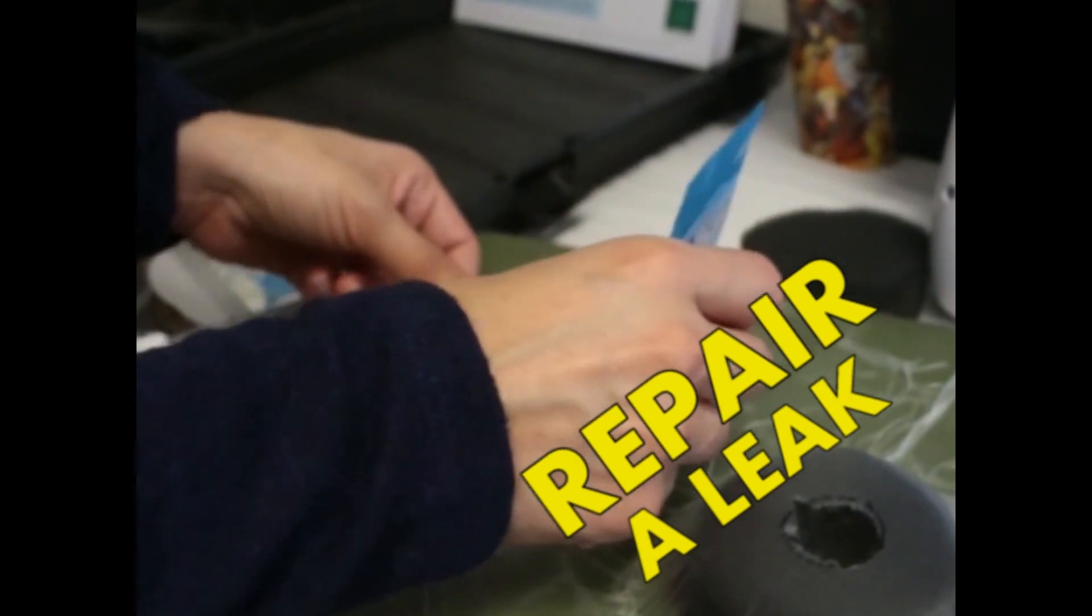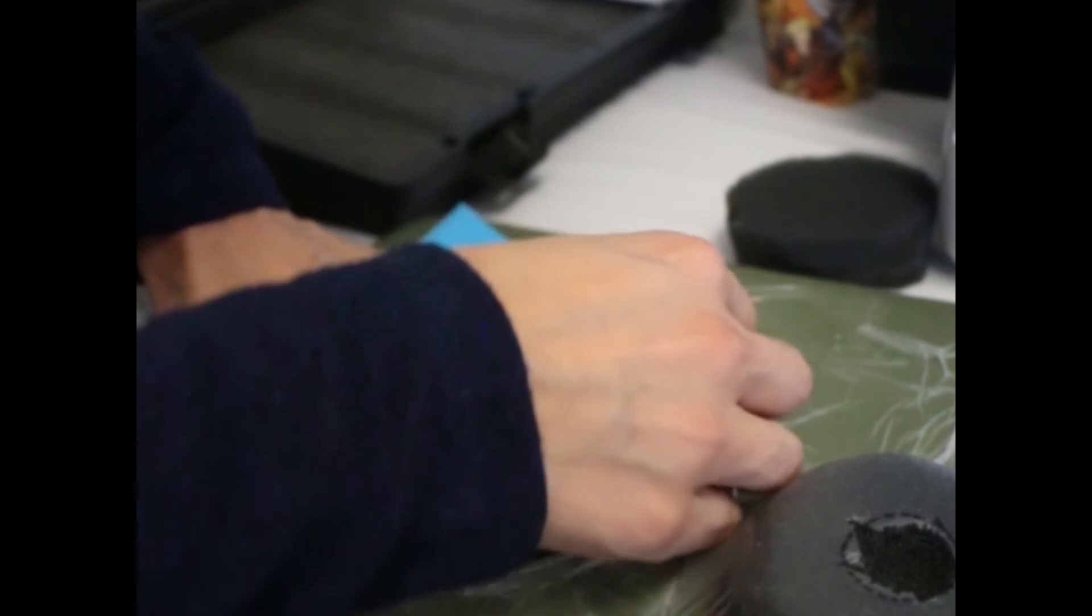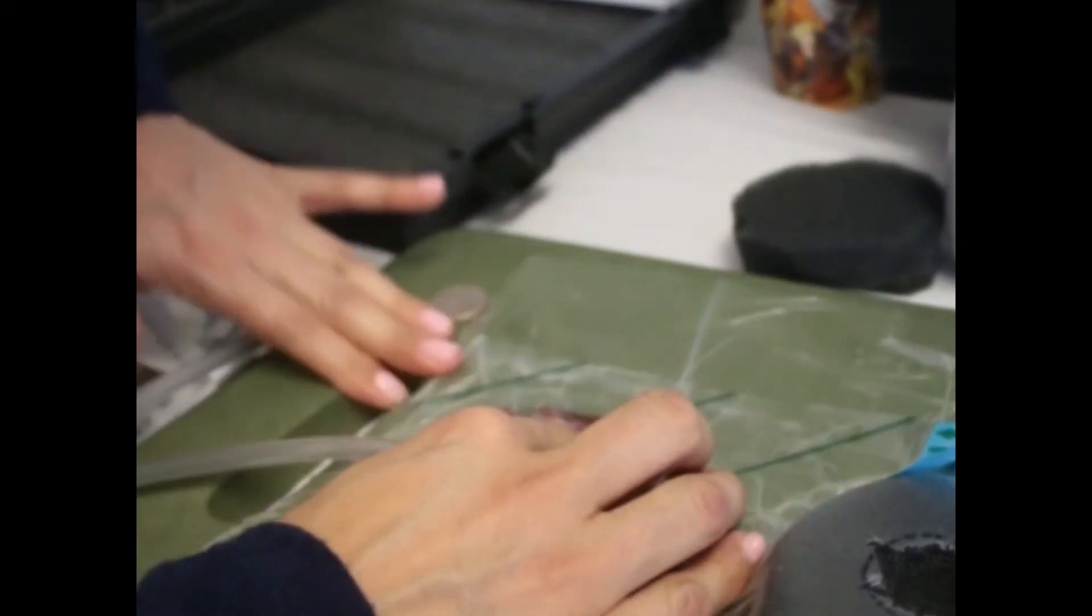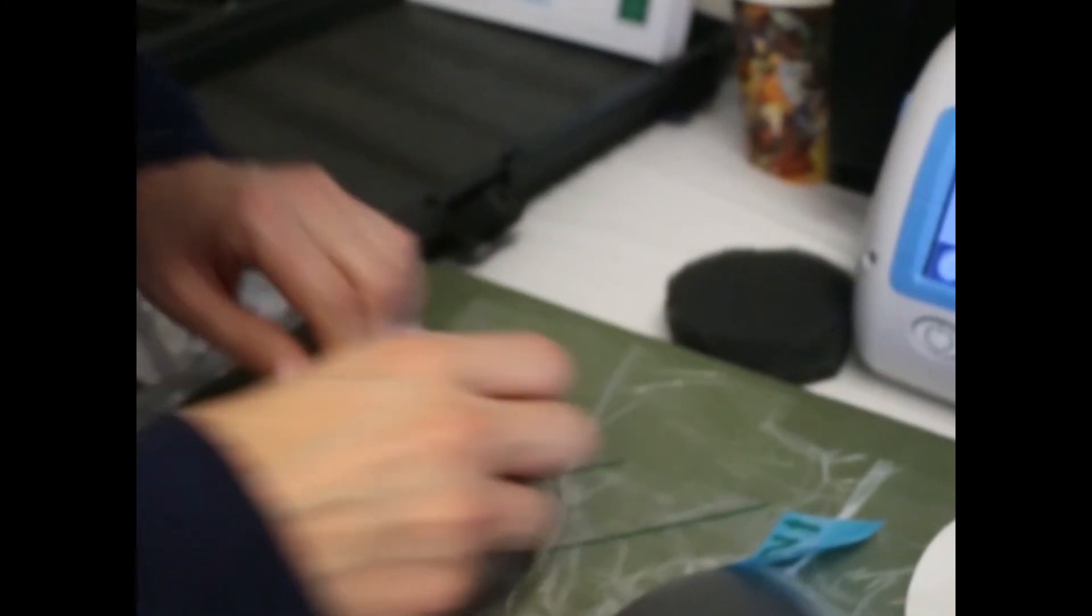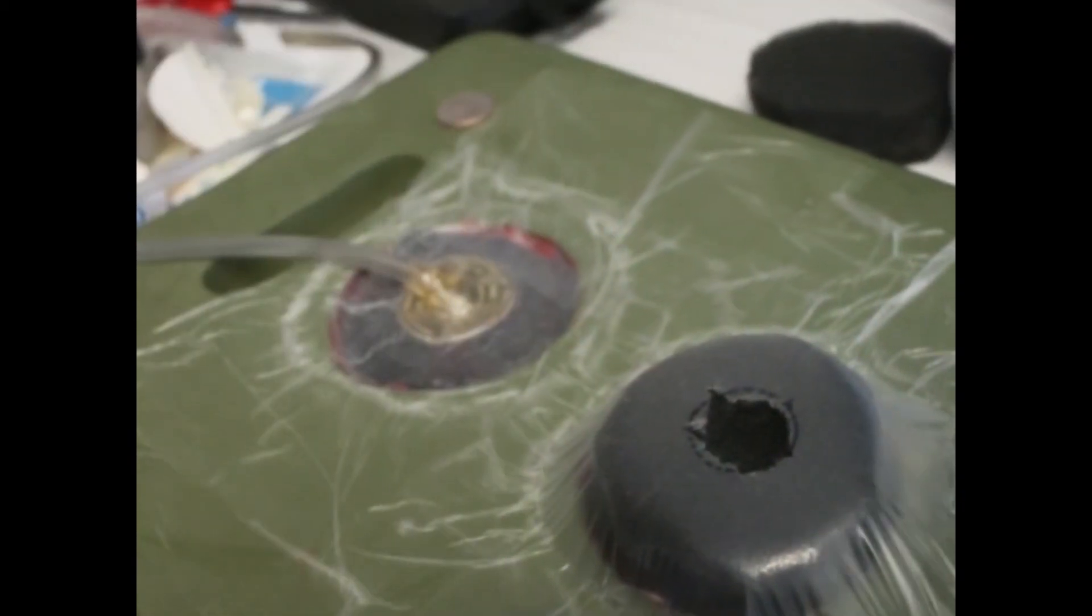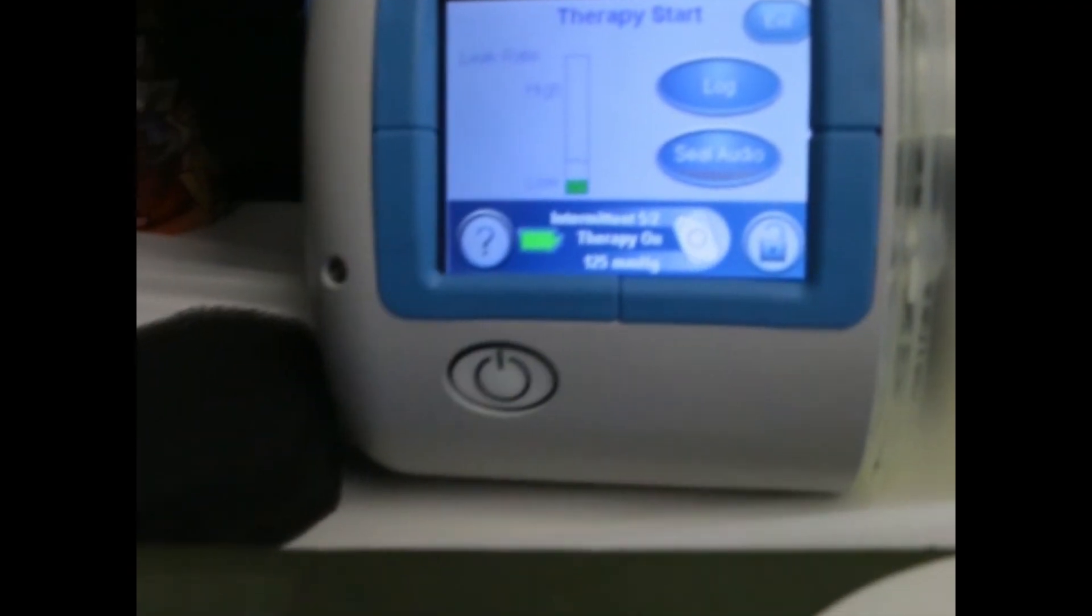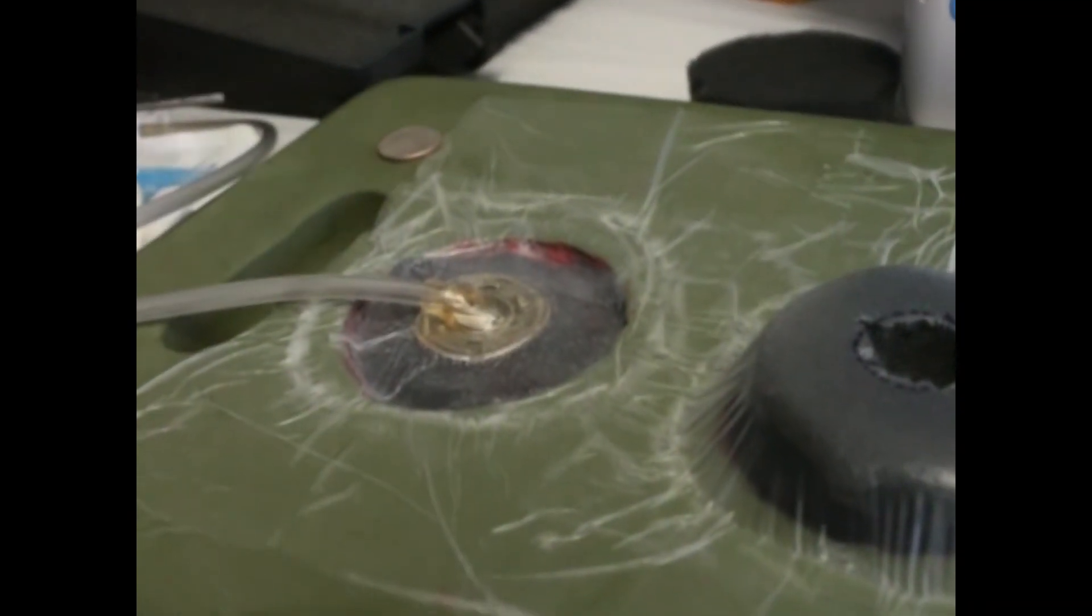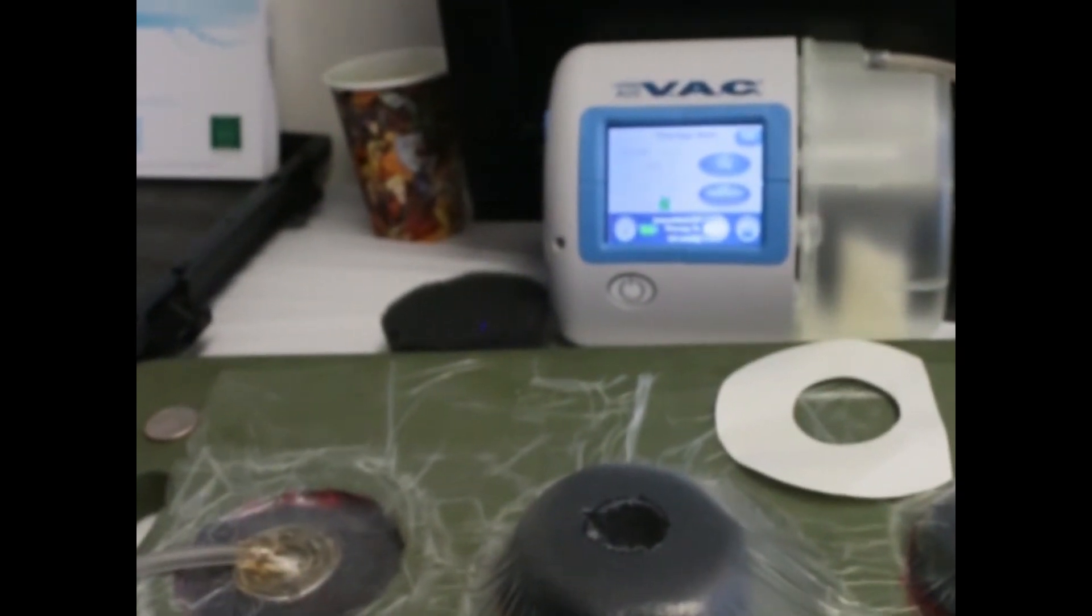Bless you. I'm under a lot of pressure. To repair a leak. Repair a leak. Do you know where it's leaking? Yeah. Oh, bless you. Very nice job. See how simple. You didn't have to tear it up and all that stuff. Oh, but still there's more leak. Low, low. There we go. So it just takes time for it to repair. It's a smaller machine, so maybe it takes a little longer. Okay. So you just put more drape.